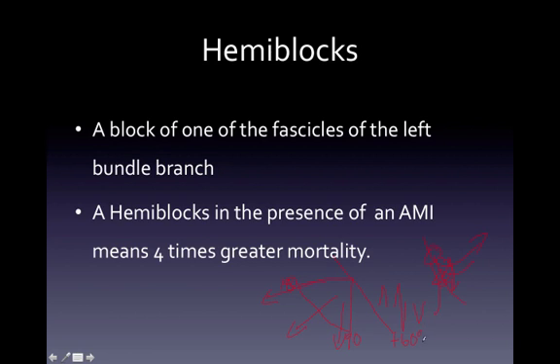So, talking about lead 2's perspective, to the 120-degree camera shot here on lead 3, it will look above the isoelectric line. And to lead 1, at 0 degrees, it's going to look like it's below the isoelectric line. And we're talking about a preponderance, or most, of the QRS waveform.